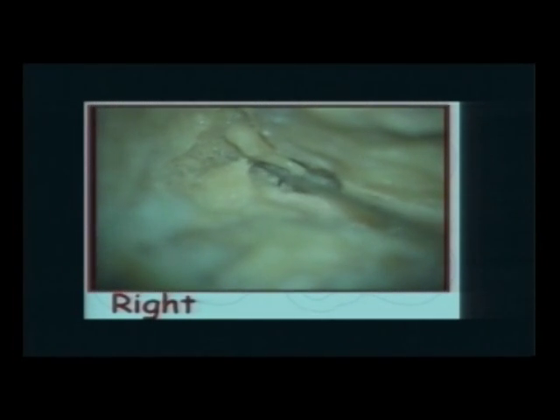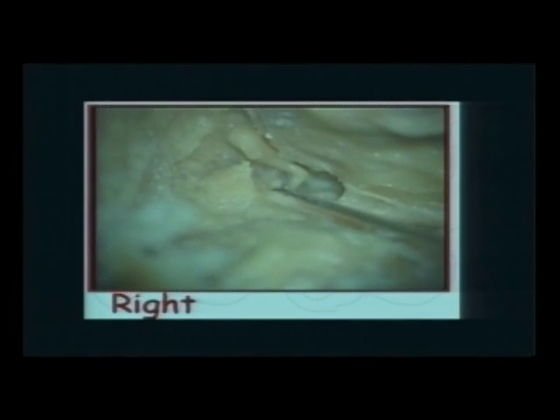In some patients, it's very difficult. You have to remove the incus and put it back. So this is just, I'm bragging that I can do that. But I must say honestly that sometimes I can't do it. I have to remove what? The incus.